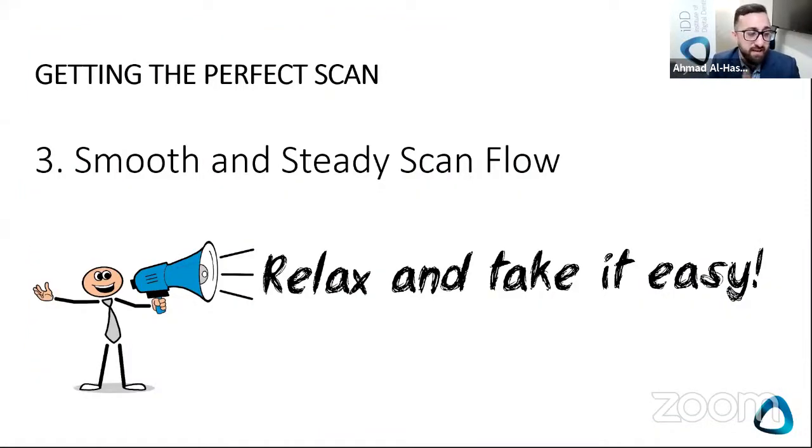The last thing that I routinely see newbies make mistakes with is they're not smooth enough. Here's an example. They're either too slow, like snail's pace, or they're erratic. They move from here to there. Following the scanning strategy is key to avoid this erratic nature in your scan. Follow a set path and just do it smoothly and steadily.